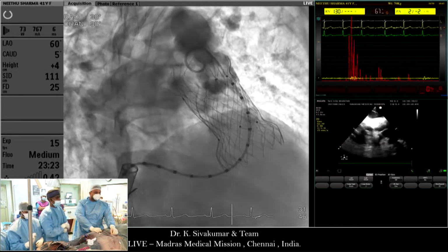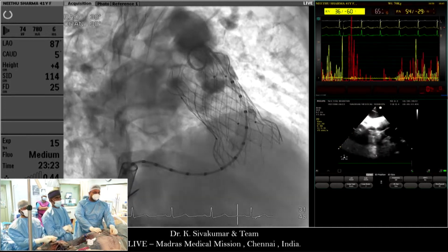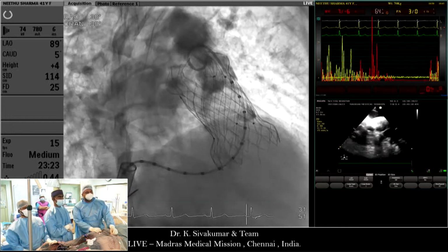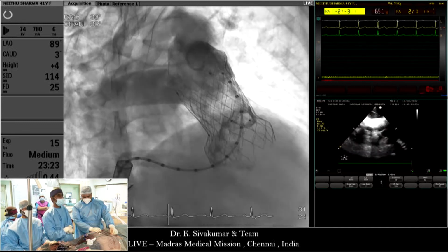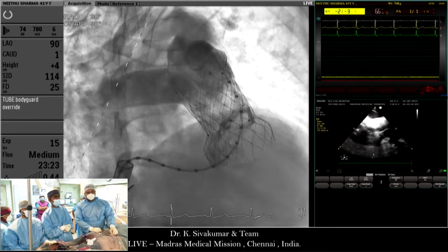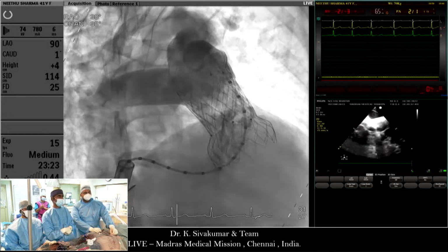Yeah. Lateral. On this angiogram, your RPA looks good because the distal flare is uncovered, isn't it? So you're going to get good flow into it. And just confirm that on the lateral. Yeah. Shiva, thanks for just coming. To confirm, this is 25 millimeter length, right? 30. Oh, 30. Okay, sorry for that.